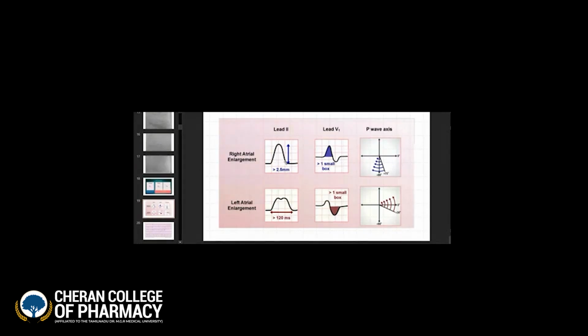Note that if the atrium is enlarged, the patient might be suffering from COPD, and cor pulmonale might be the commonest reason for the atrial enlargement.